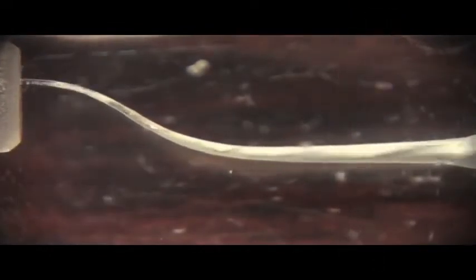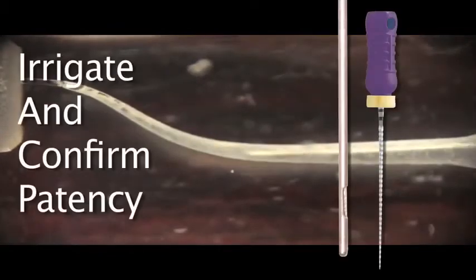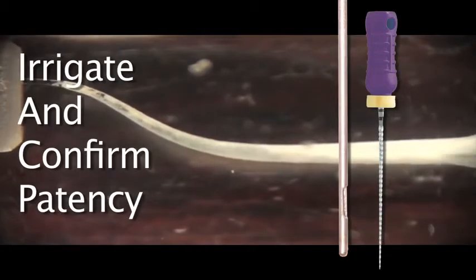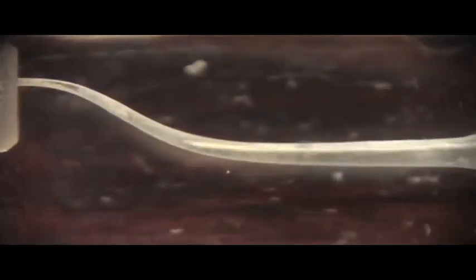With patency confirmed, the Wave 1 file is reinserted and the canal shaping continues. After each pass, small hand files are employed during irrigation to reconfirm patency. In the case of this plastic block, three passes were all that was required to achieve a beautiful shape.